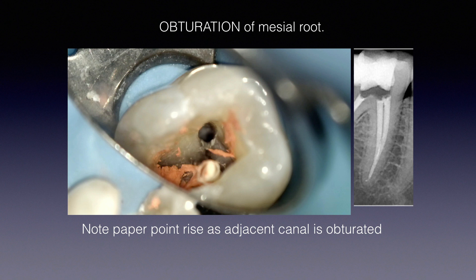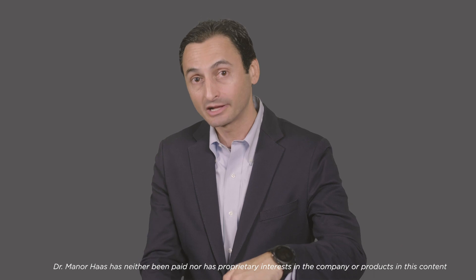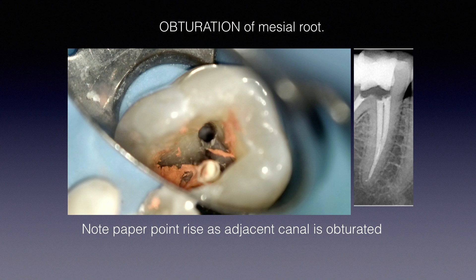I want to obturate the mesial root of this particular tooth because you can see how the mesial canals merge apically. You might wonder: how do you obturate one canal when the other joins it? Note there's a paper point in the bottom mesial canal. As I place the gutta-percha in one canal, watch that paper point — it actually rises up. That's because as it fills one mesial canal that joins the other, it backfills the second canal rather than extruding apically.